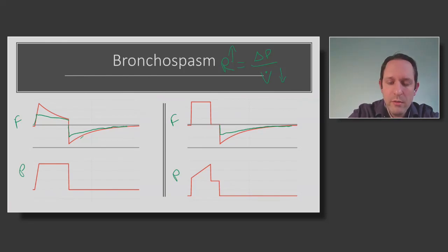And then because we are controlling flow, it's not going to go down, it's going to stay, and your pressure is going to go up. Therefore you would also have an increased resistance and your plateau should remain the same. So that's the relationship with bronchospasm. So just by understanding what mechanisms should change, you should be able to look at the waveforms and understand what has changed.